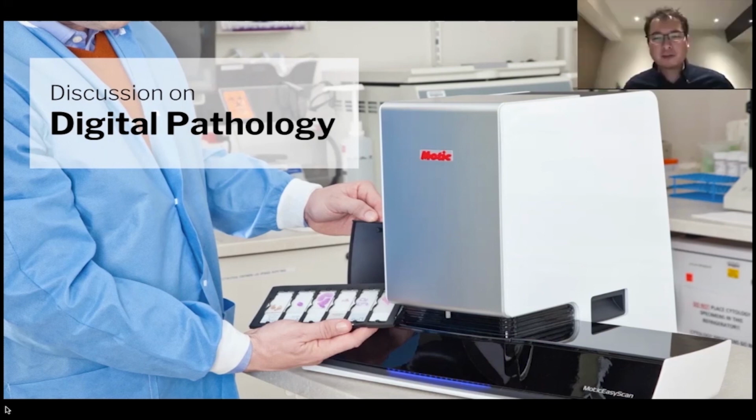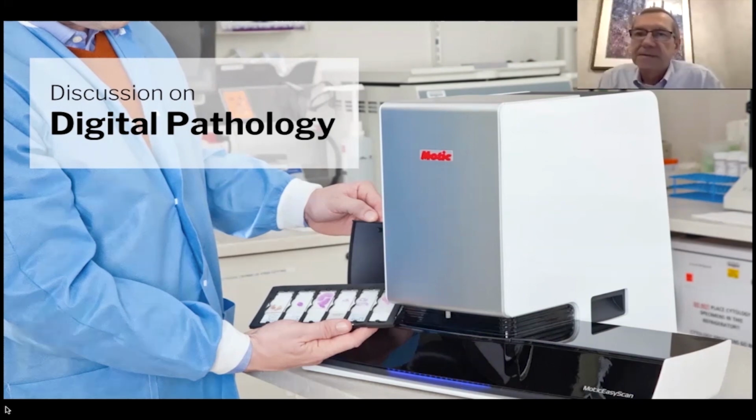Yeah, and I'm sure it offers much more flexibility for the pathologist as well. Definitely. The fact that you can be reachable anywhere and anytime versus having to, like we said before, schedule a pathologist for a particular procedure, it's a huge difference. Not only for the hospital, but mostly for the patient. It does not have to wait for a schedule.